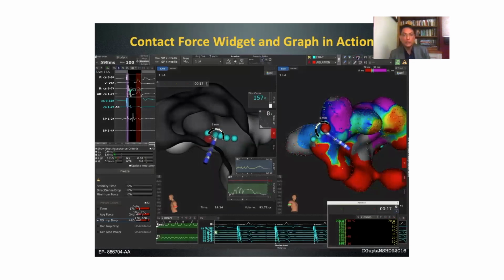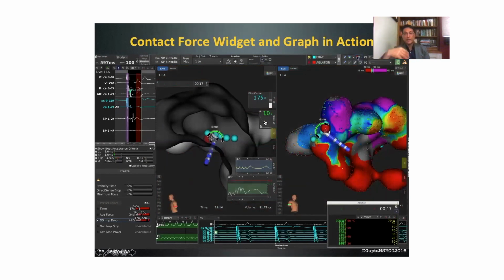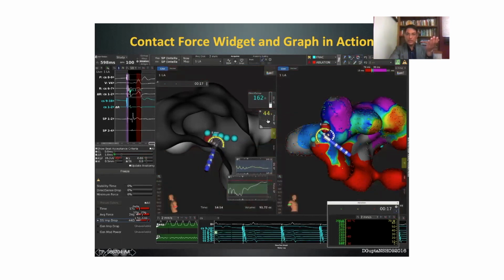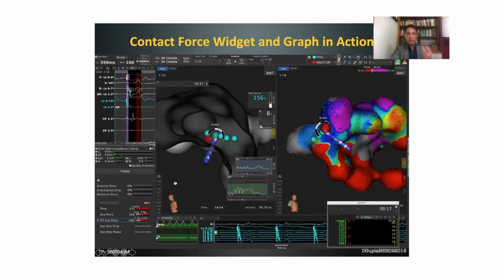Now this is how the widget is in action. Have a look at this. As I'm changing the direction of the angle, it's changing from 90 degrees to 0 degrees. And as I'm increasing the contact force, this value is changing. My set value is between 10 to 40 grams, so as long as it's between 10 and 40 grams, this is green. As I keep increasing the contact force, it becomes yellow, as you will see, and then finally it becomes red. So here you are: white when it's not quite at the level, green when I'm in my target range, yellow when I've gone above the target range, and then red when I have reached the 50 threshold. You can see it says high, and the whole screen starts flashing red. It's a warning sign that your contact force is reaching levels where it might lead to complications.